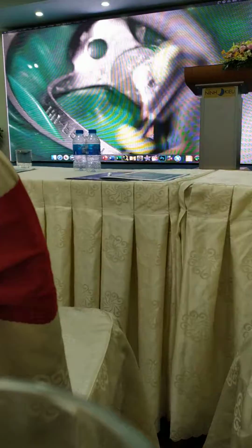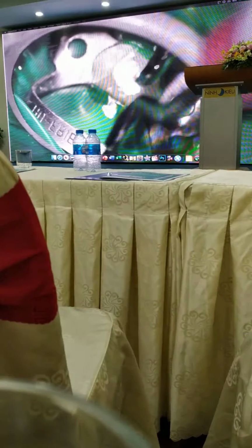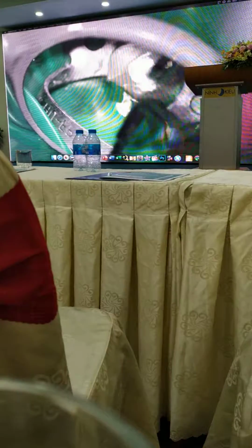As you can see, in every case I use the Genesis device for cutting the gutta-percha, because that device can be used for cutting the gutta-percha in all your cases.